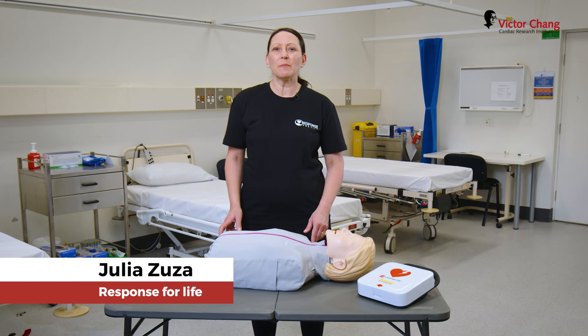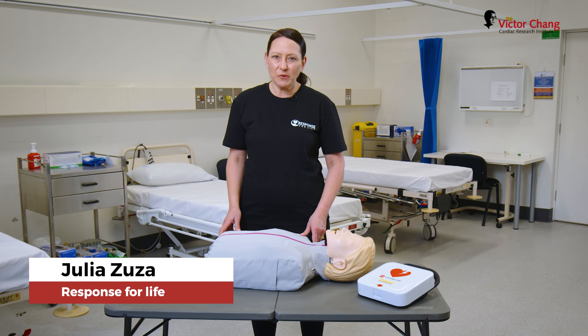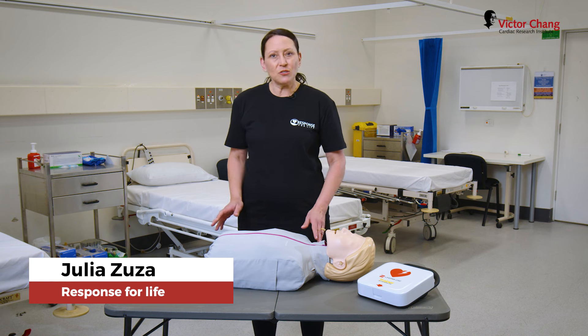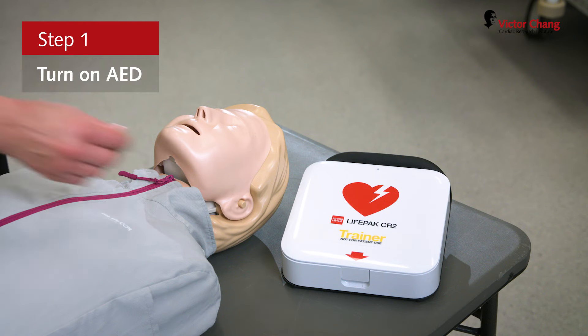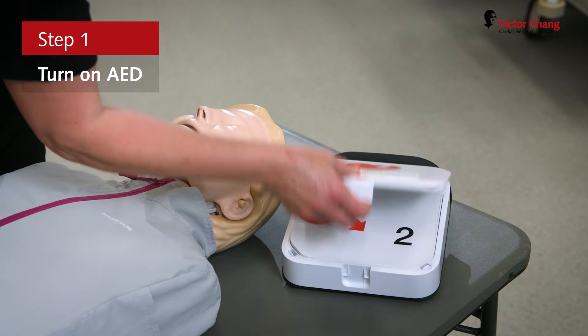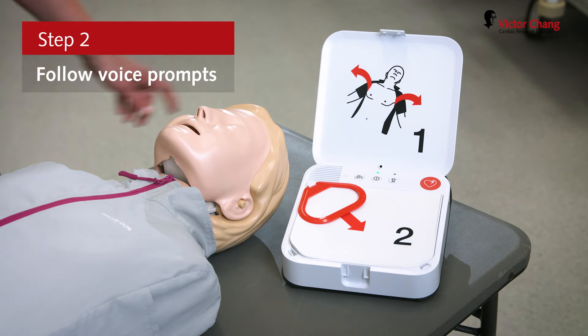In this video, I'm going to demonstrate how to use a defibrillator. By this stage, you would have started CPR already. Once the defib arrives, you're going to turn it on and you're going to follow the prompts.